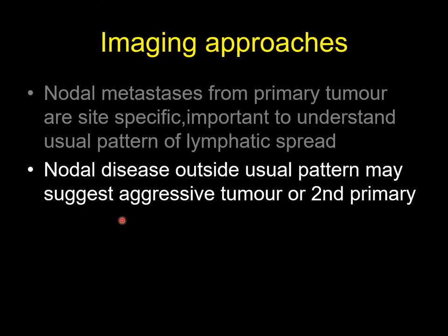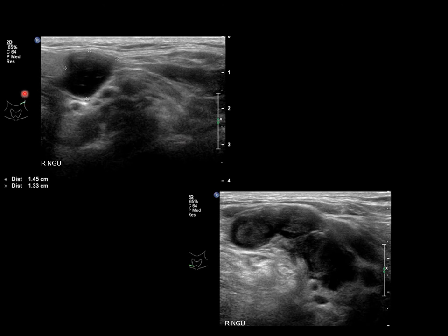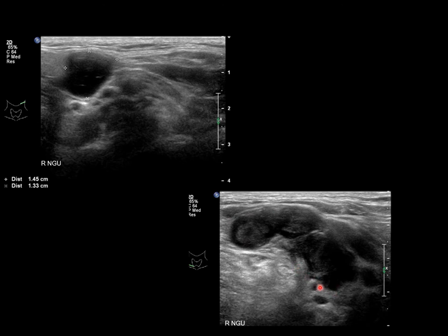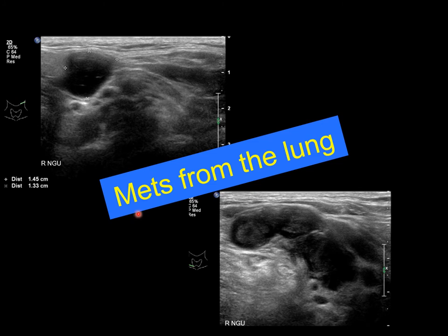Nodal disease outside the usual pattern can also suggest an aggressive tumour or a second primary. Here at left level 2 you have a node that is markedly hypoechoic with a missing hilum, and looking further down to the right side of the neck, there is disease seen at two different levels on both sides of the neck. Here at level 4 there are multiple lymph nodes, truly abnormal, presented bilaterally — and this was a patient who presented with metastasis from the lung.